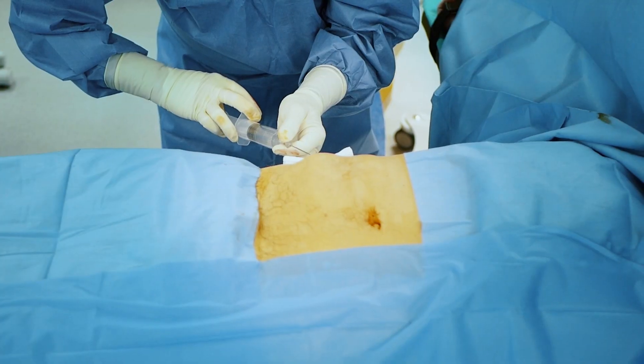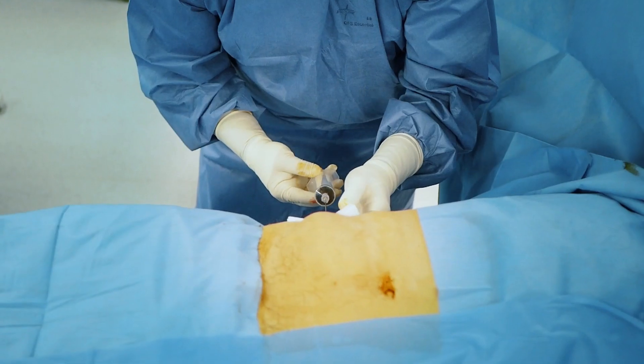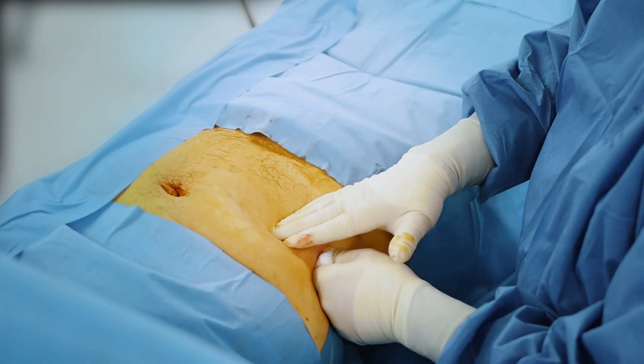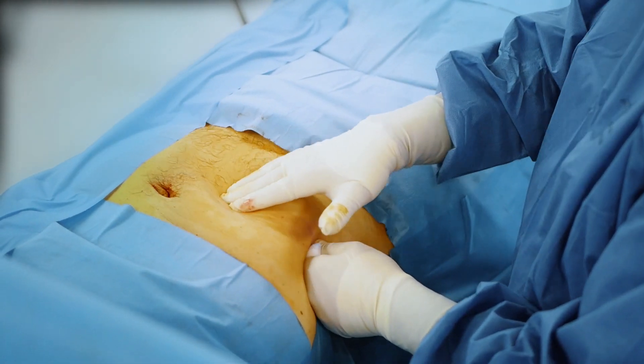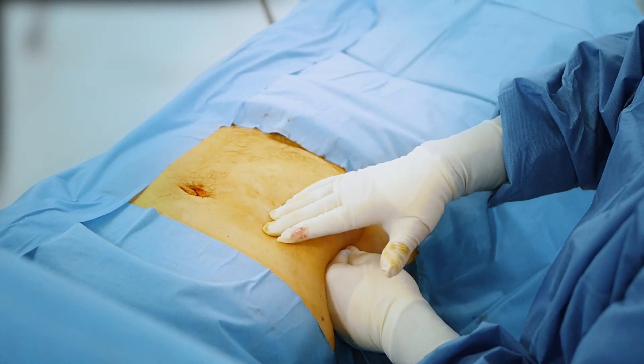After infiltration of an average volume of 150–200 ml of Klein solution, wait 10 minutes. You can perform a digital manipulation of the abdomen to help the distribution of the solution into the subcutaneous layers.